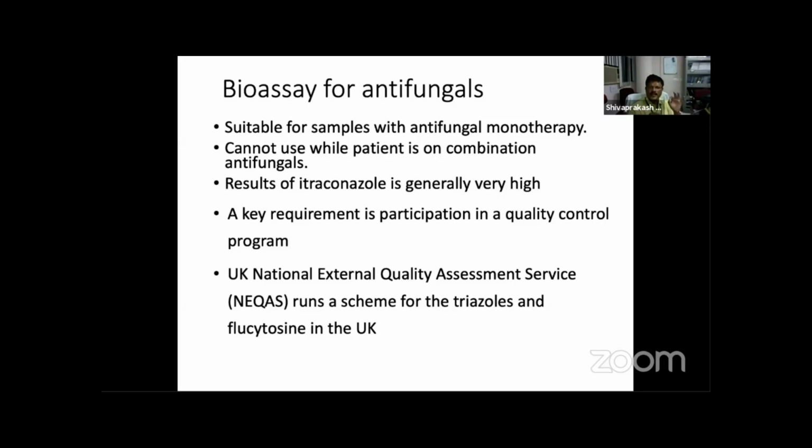They had around 4 or 5 patients given the combination. In that case, they standardized these Candida parapsilosis isolates to use as a standard, and then they identified the levels. But for combinations, we need to work on it. We should have different combinations of isolates and QCs to get good results. Results of itraconazole are generally very high. I will come to it later, because itraconazole you will see in 2 different forms. That's why you get very high results, and it is very difficult for bioassay. So HPLC is always better.